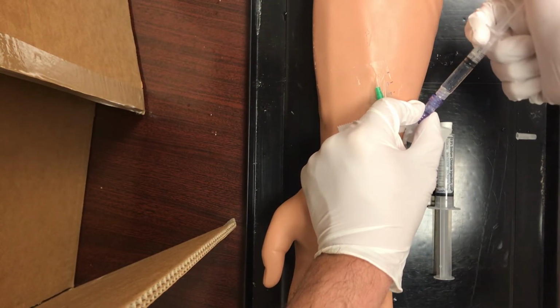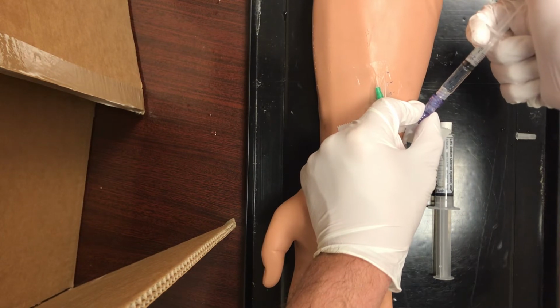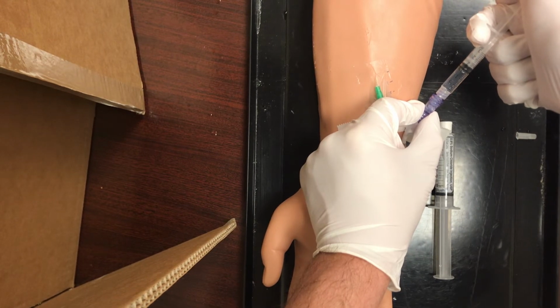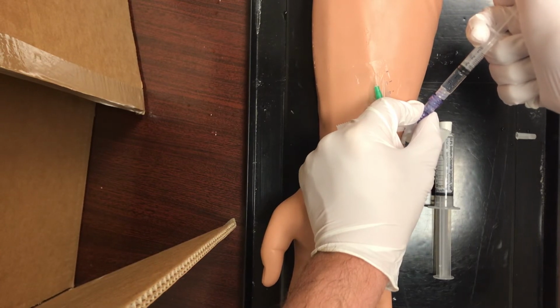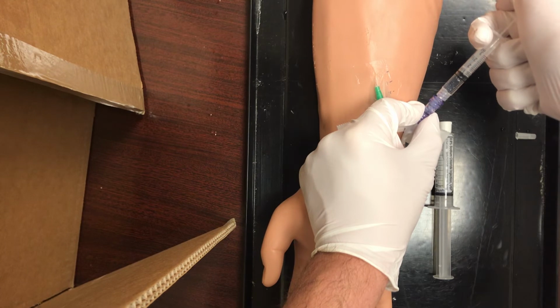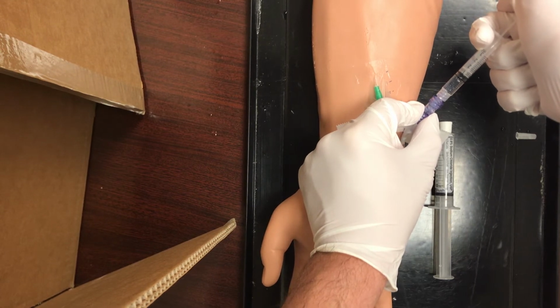Again, this first one I'm giving over the first 15 seconds is just the 0.5 ml. And then I'm going to continue. Okay, keeping an eye on the time, making sure I'm giving this correctly, monitoring the patient for any changes.